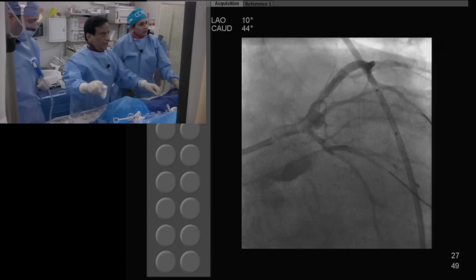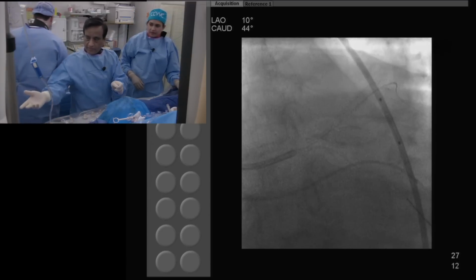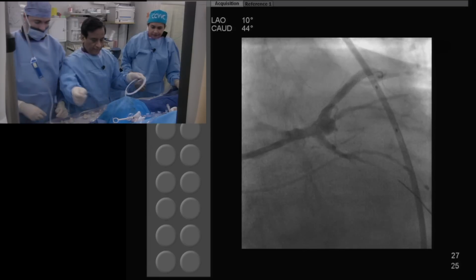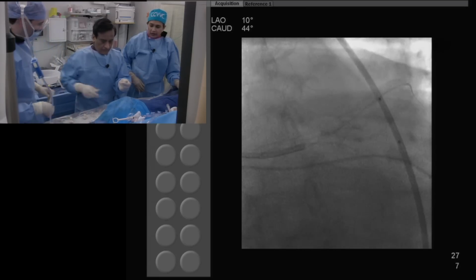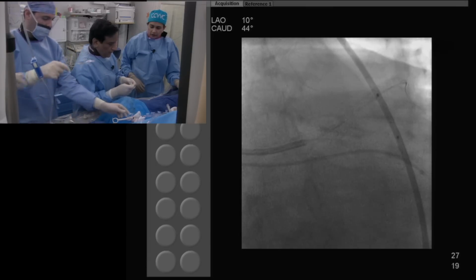You want to put another stent there? Yeah, a little massage. This balloon, we'll go to another view. That's a separate issue. You don't want to go to 5 for that? I think I would not. 4.5, another 4.5. All right, 4.5, 8 millimeter stent. Don't get crazy. 3.58. Yeah, it's a 4.58.